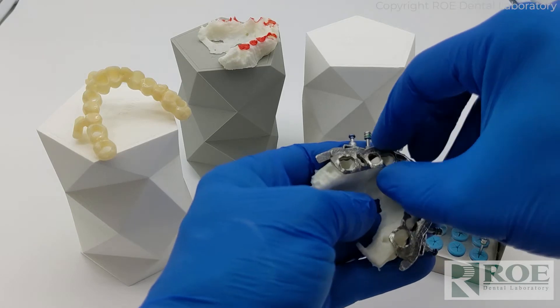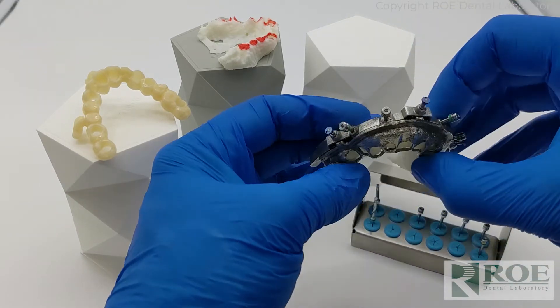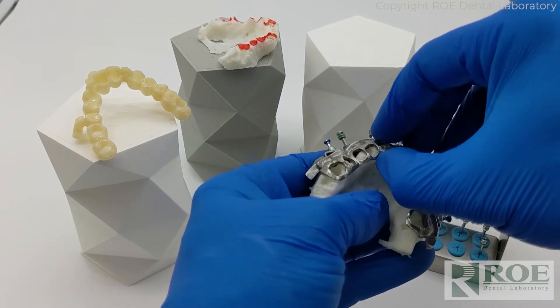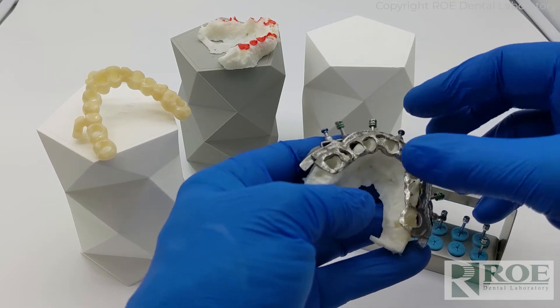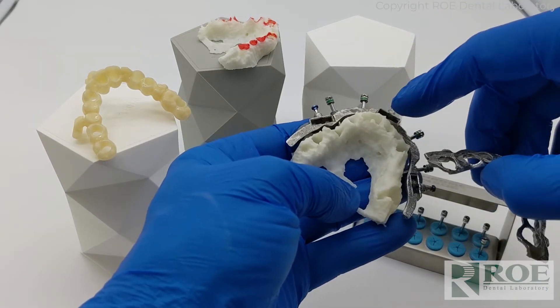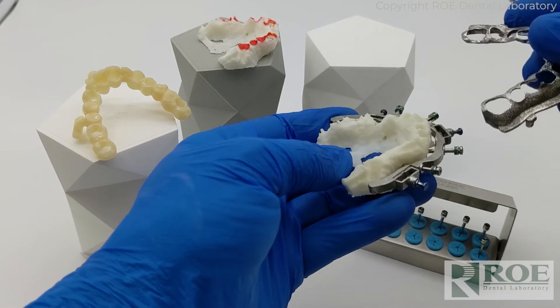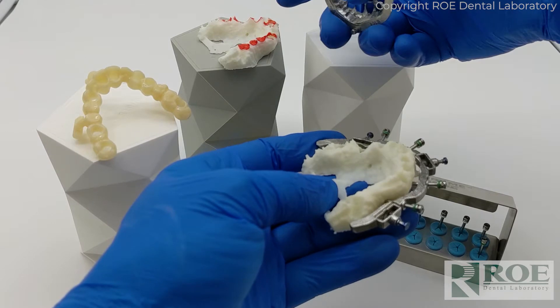What we do is adjust the bone sockets and the scalloping until the scallop guide seats passively. On some cases there is more aggressive adjustment than we have on this case. This case hardly has any adjustment at all. There is red, so we did adjust all these areas you see.